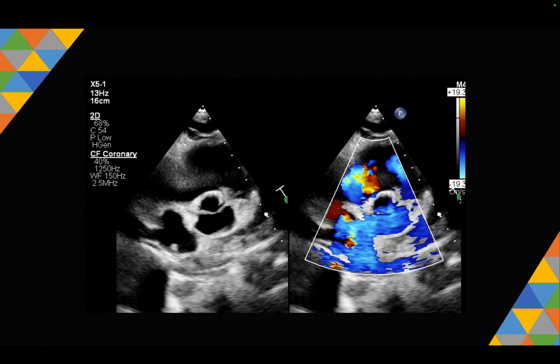The next most important aspect: the flows in the coronary artery are at a slower speed. Once you are looking at a slower speed, something like less than 100 centimeters per second, you need to lower the Nyquist limit. The velocity scale has to be lower, something like less than 20 in a usual case of coronary artery disease.